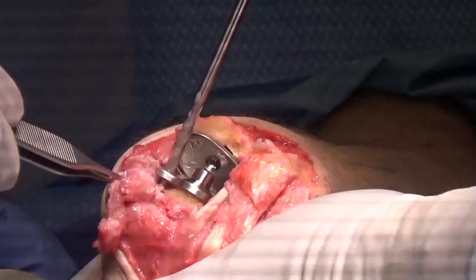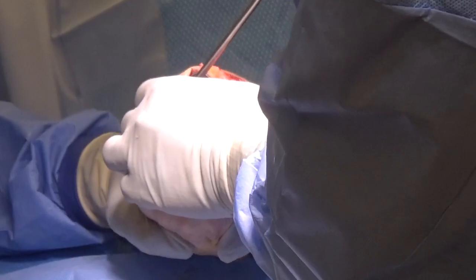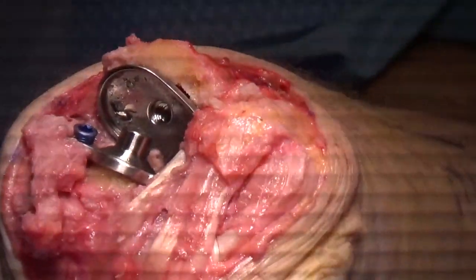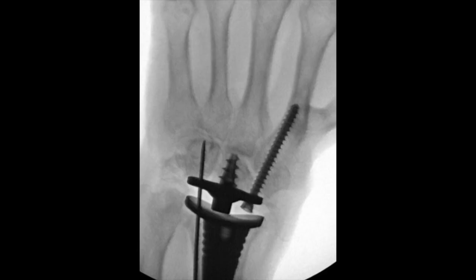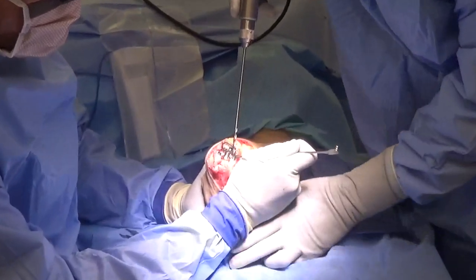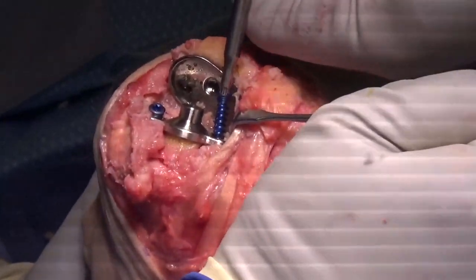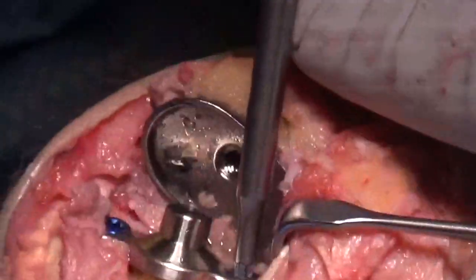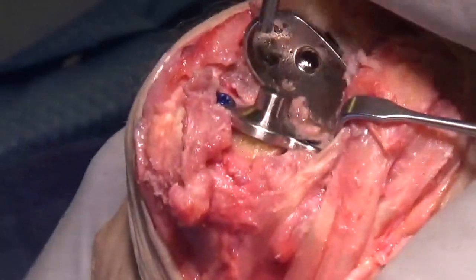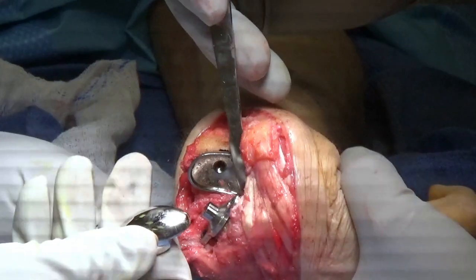The index metacarpal is drilled. And our first screw is being placed. Notice it's not being tightened all the way, but snug. Our second guide wire is being placed for the screw. It's inserted right into the base of the hook of the hamate, confirmed on the fluoroscopy, and drilled. The second screw is placed, and then going both radially and ulnarly, the screws are tightened down. Fluoroscopy shows good position of the screws.